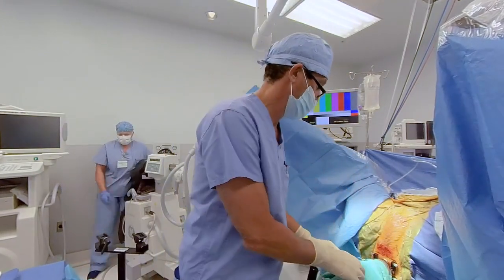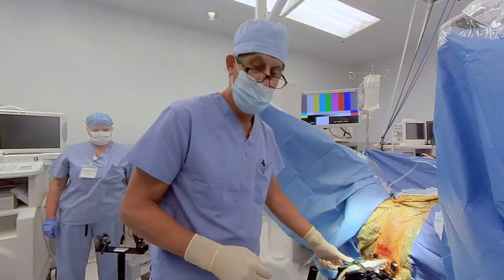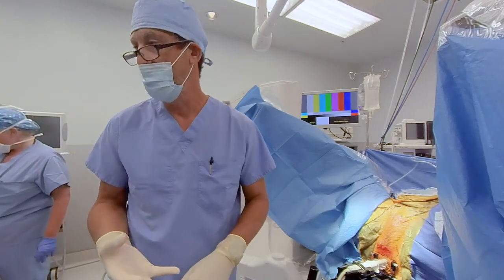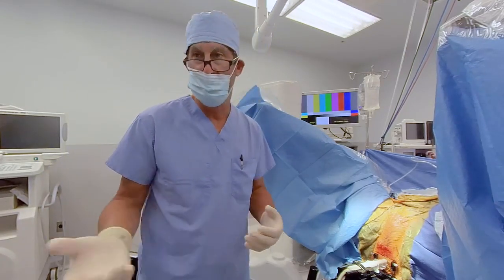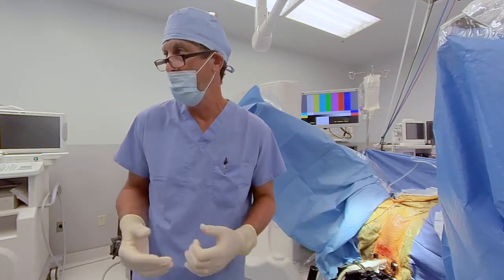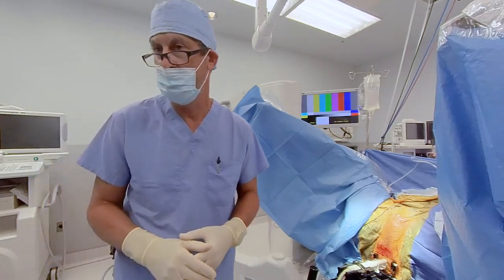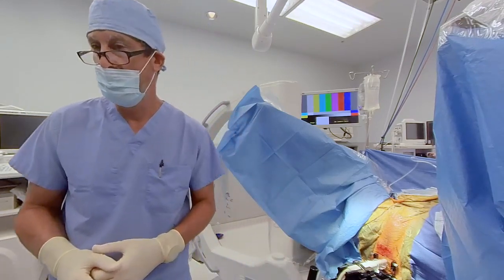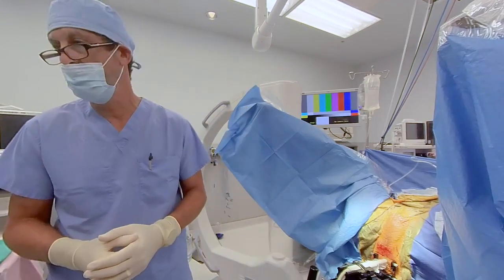Dr. Graham, while you're staying up, can you just explain we're going to do cystoscopy and a fluoro, and what do you use those tools for? So our urologist, Dr. Terranova, will do a cystoscopy to make sure that the urethra is clear of any blood clots, that the bladder shows no blood clots, in addition to make sure there's no migration of any seeds into the urethra or the bladder wall that can be retrieved with the cystoscope. And also to make sure that it's safe for the patient to have his catheter removed and to be able to go home without a catheter. We do a fluoroscopy primarily to look at the positioning of all of the seeds to make sure there's no significant migration away from the prostate. There are occasional times where you can have a seed migrate outside the prostate and it needs to be documented, both for NRC purposes as well as for dosimetry purposes.